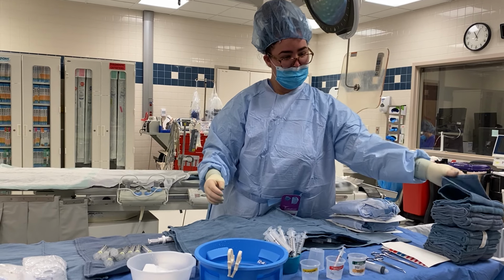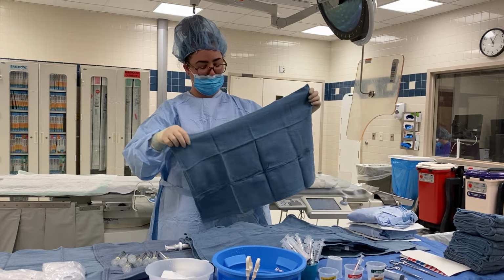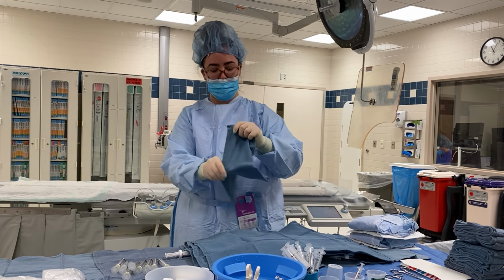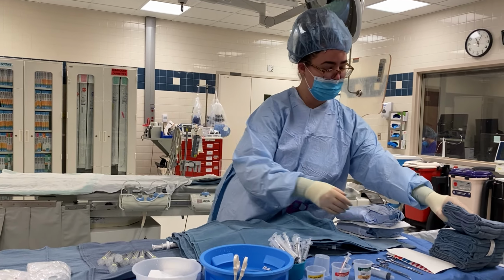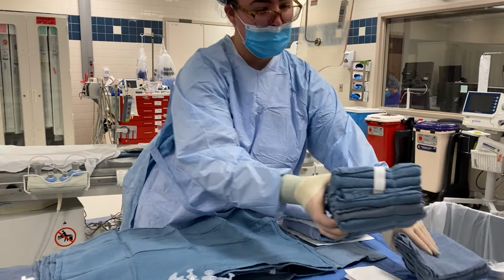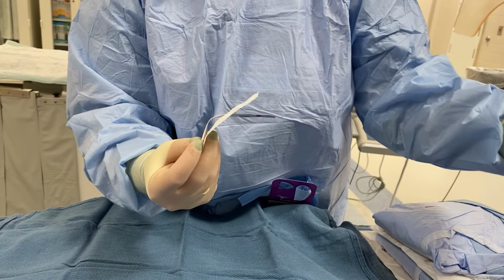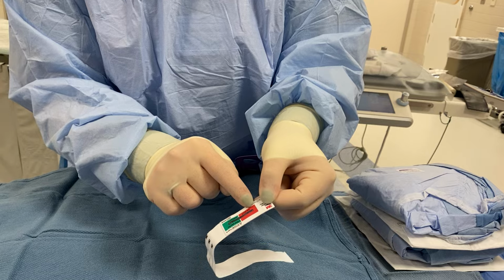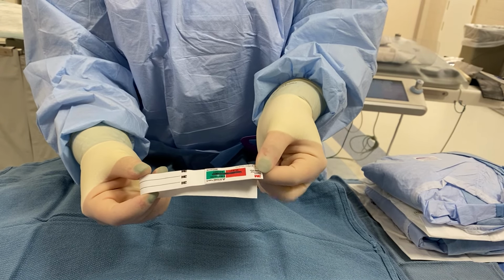And if you ever have any equipment that's coming from sterile processing, so it needed to be re-sterilized, there's gonna be an indicator with the equipment that indicates whether or not it was properly sterilized. Because these towels came from sterile processing, there's gonna be a tab like this that's tucked into the towels, and it's gonna tell you whether or not they were sterilized. So for this, because the full line is black, it made it all the way to accept, which means that they're appropriate and we know that they're properly sterilized.